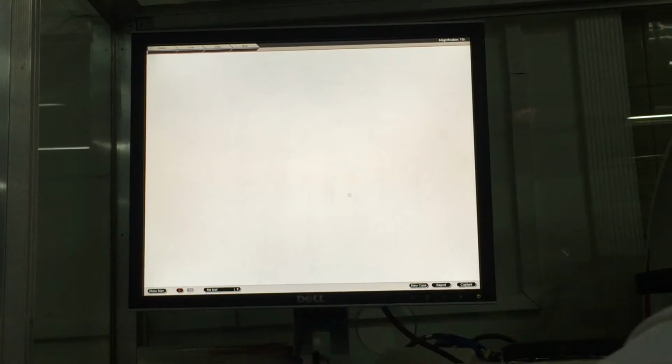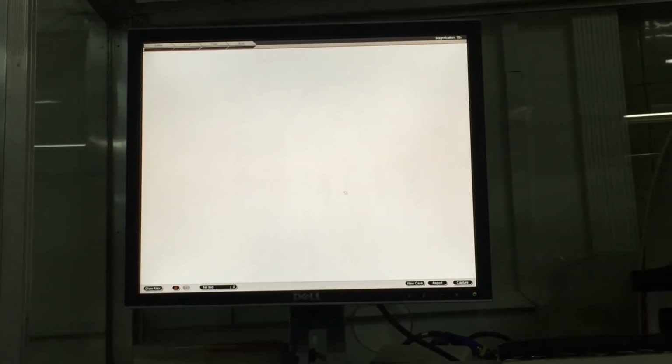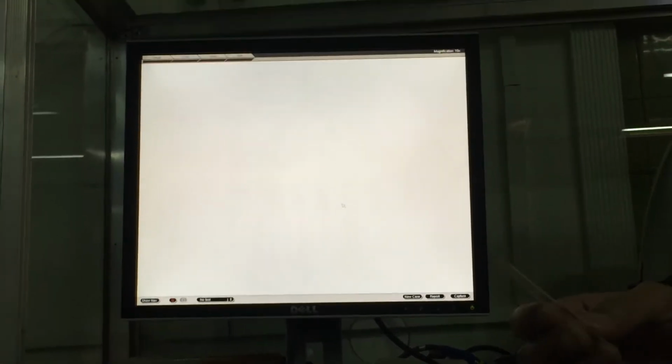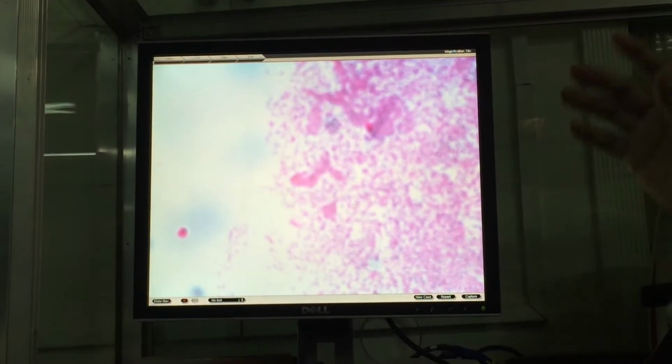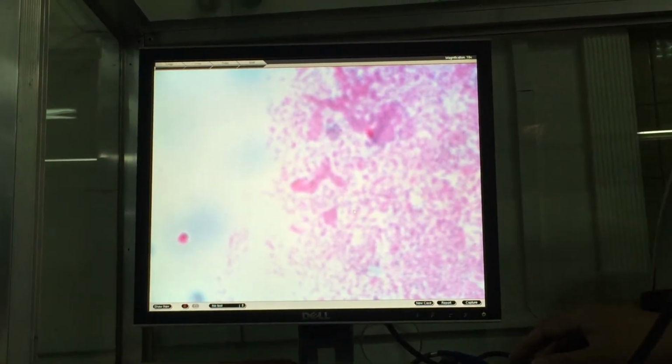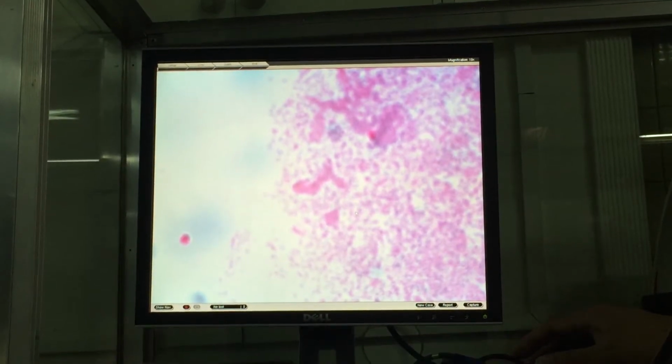Next is urothelial transitional cell carcinoma. When you say urothelial or transitional cell carcinoma, this is the most common tumor of the lining transitional cell epithelium. So your transitional cell epithelium lines what?